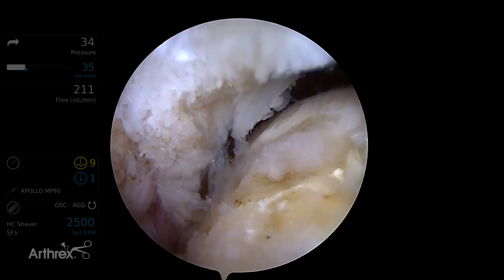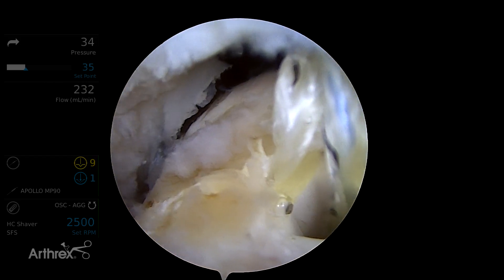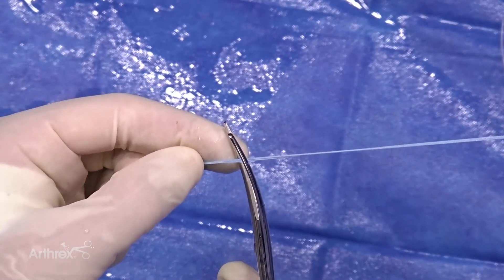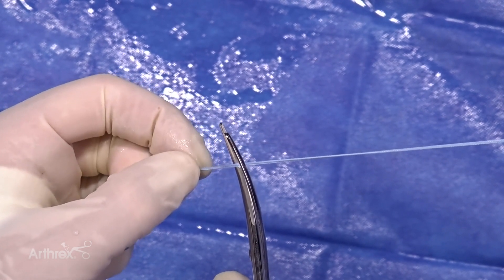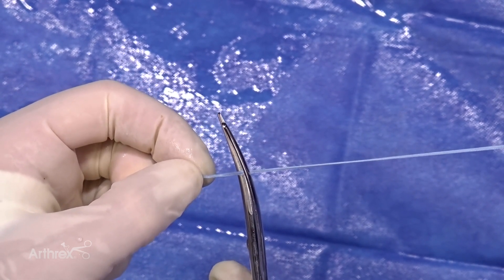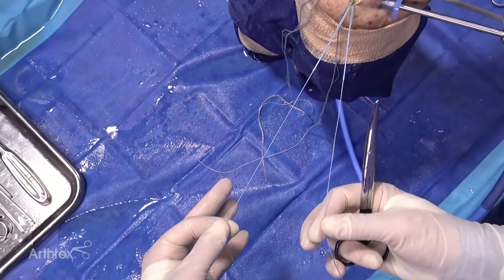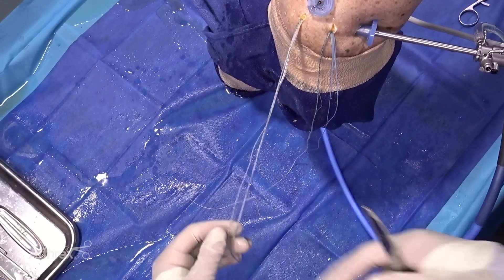There are the posterior tapes and you can see all the slack is out of those, and all the slack is out of the anterior tapes. This is where the ends of the tapes are joined together and spliced together for passing. We don't need to pass these as a unit anymore, so we're just going to cut just proximal to that splice — like so — and now we have two individual fiber tape ends, and then we'll do the same thing for the anteromedial anchor.